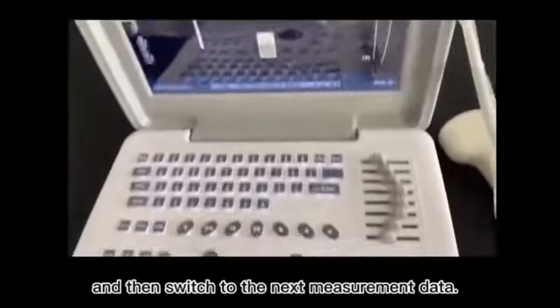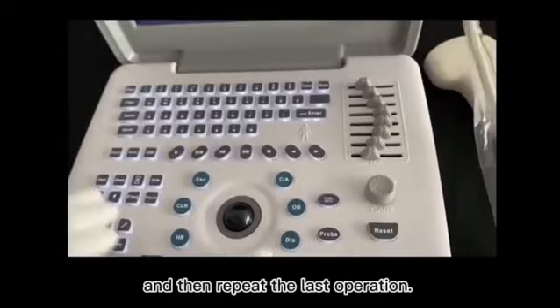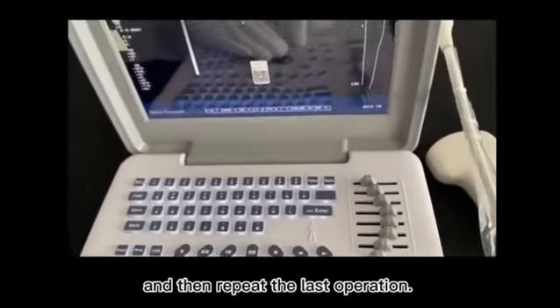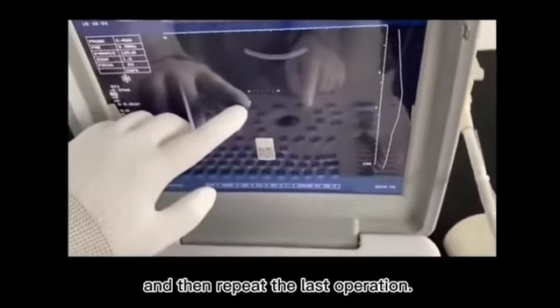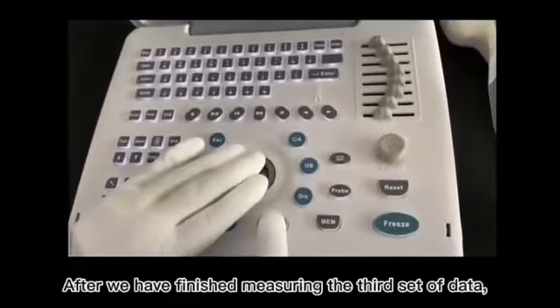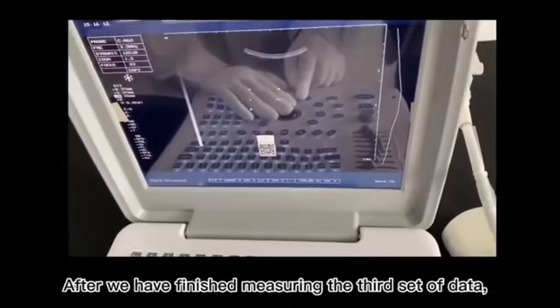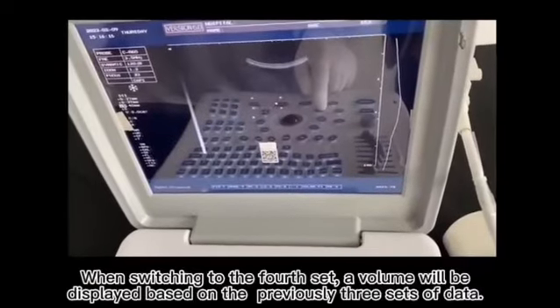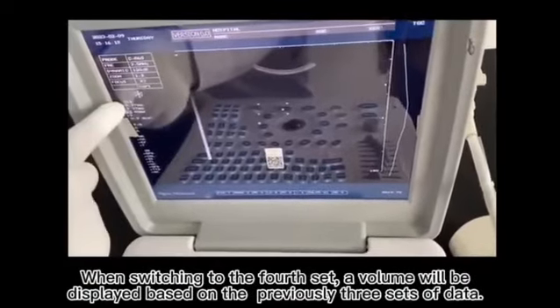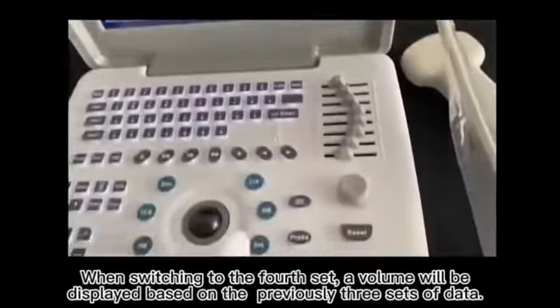And then switch to the next measurement data and repeat the last operation. After we have finished measuring the third set of data, when switching to the fourth set, a volume will be displayed based on the previous 3 sets of data.